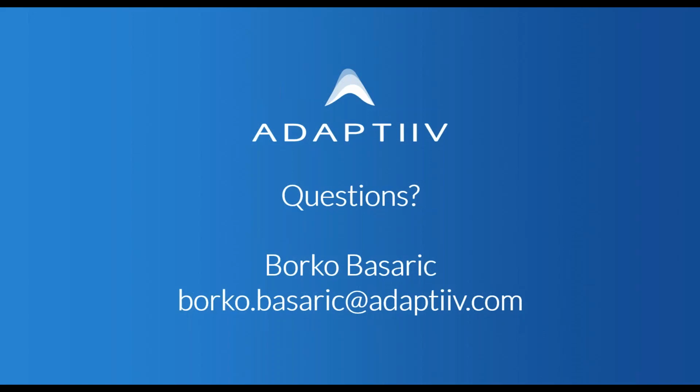We can share a paper on that. It's from Dr. James Rober from the NSHA, so we can share that paper for you to see. We'll send a link to that paper out with the webinar recording to everyone.